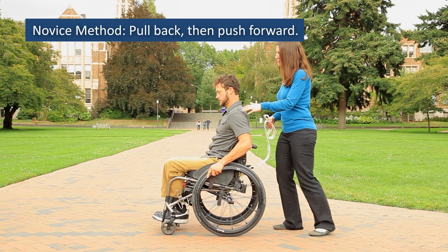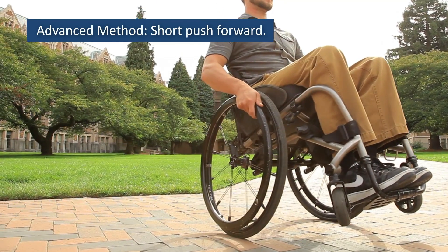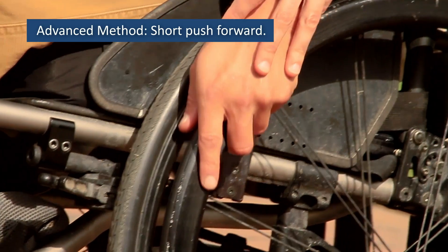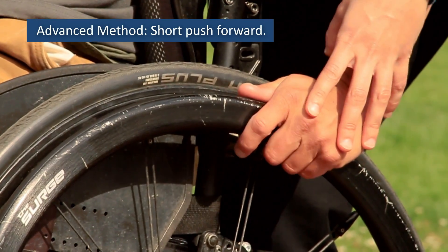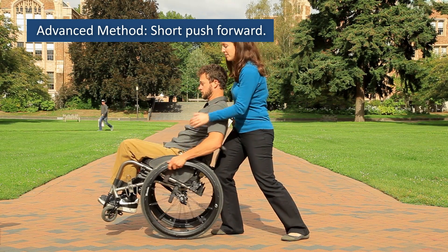Once you're comfortable with this method, you can advance to the more versatile method of popping back into the wheelie. Begin with your hands positioned on the upper back portion of the hand rims, then use a short rapid push forward on the rims to lift into a wheelie.